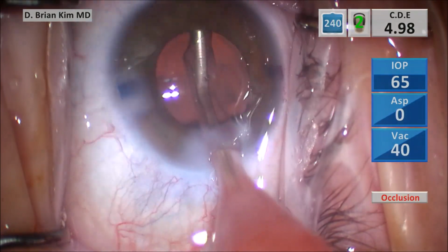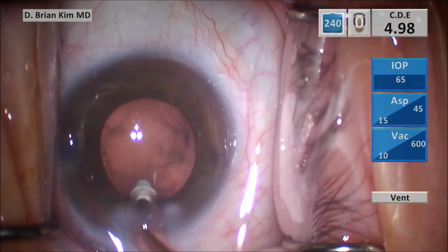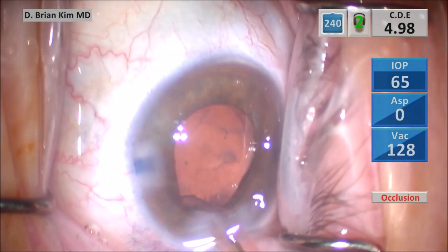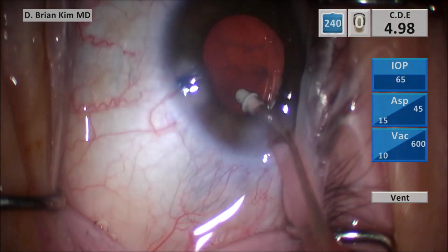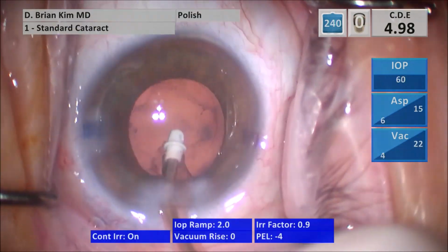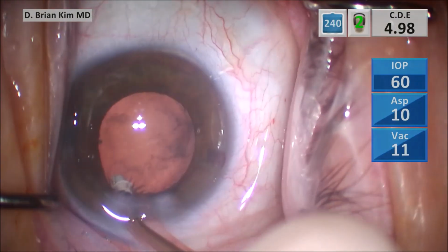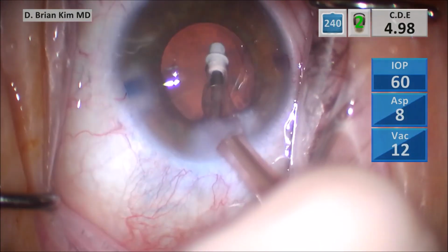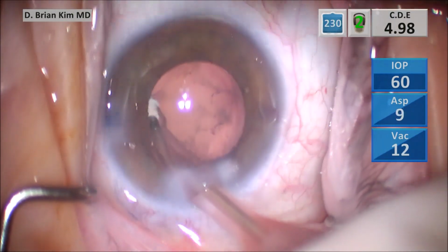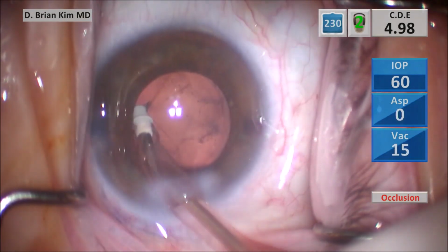Going underneath the rexis edge, just using foot pedal control to control the vacuum, making sure I don't go too aggressive with the vacuum here. Again, with these very dense lenses, I always worry about weaker zonules, so you don't want to use really high vacuum if possible. Switch to the polish mode, and I'm more aggressively polishing blindly underneath the iris edge here. As I'm polishing the posterior capsule surface, you can see there's quite a bit of posterior capsule fibrosis, which again is usually associated with these very dense lenses.